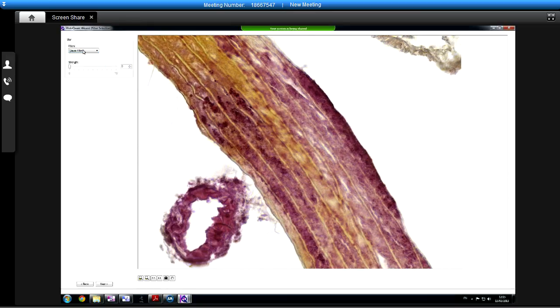So using this sort of blurring can be potentially useful, because if you look at it unblurred, yeah, there's real differentiation between the different shades, but we don't really care about that. We just want to try and see it as one object, don't we? So what sometimes helps is blurring them into one, and then the next step it will be easy just to identify that as one object.